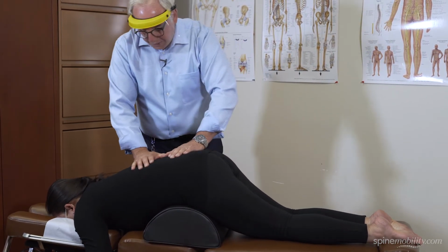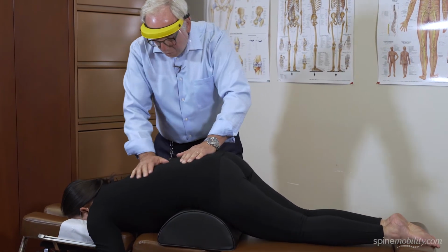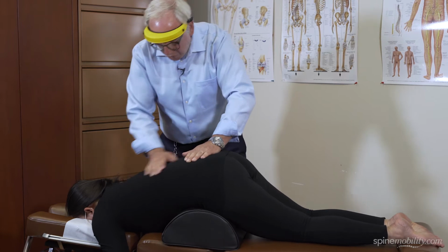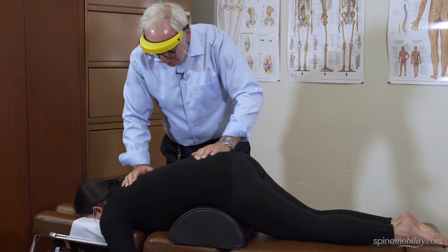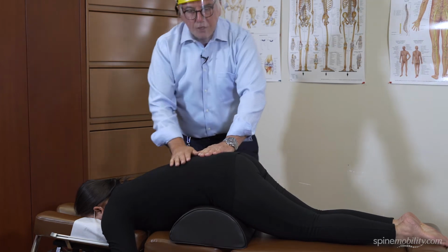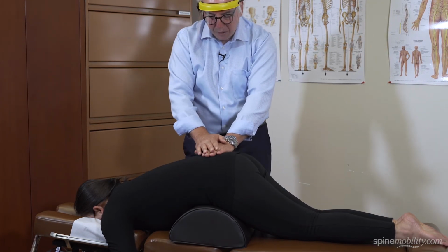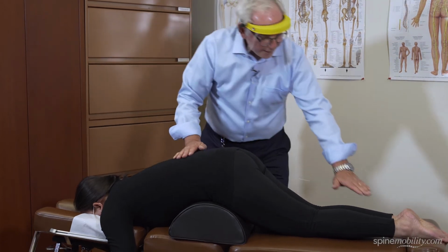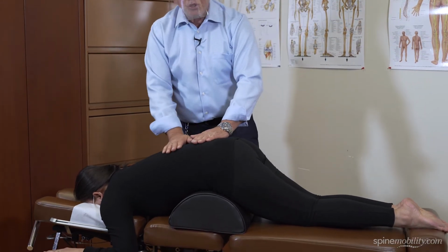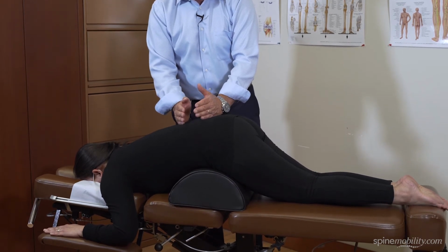Now, the various techniques are outlined in our bootcamp programs, but in short, there's mobilization techniques that you can do, as well as trigger point therapy, as well as sacral pump. The key thing is that the bolster is introducing flexion in the lumbar spine. You can see that the pelvis and the tailbone is high, the head is low, and the feet are low.